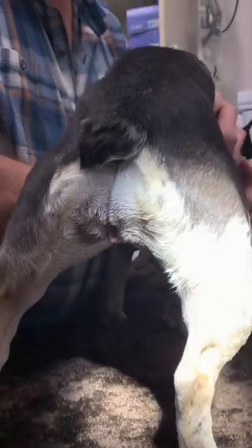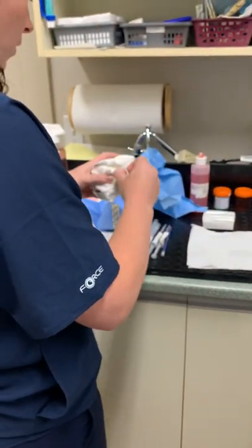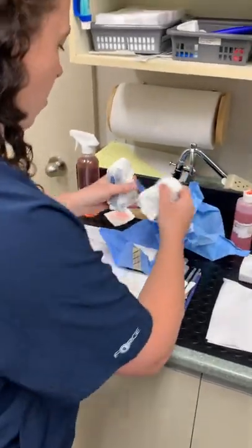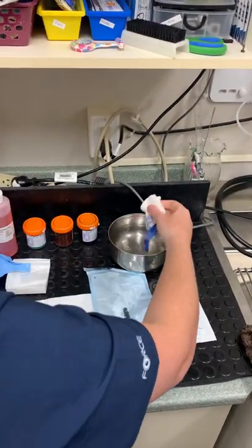As instructed, I'm going to do three preppings. So that's one. I'm going to open my sponge that I have here. This is my sterile sponge, and I can use it for some of the water, because we have to do a rinse in between each of our preps. So I'm just going to rinse here.